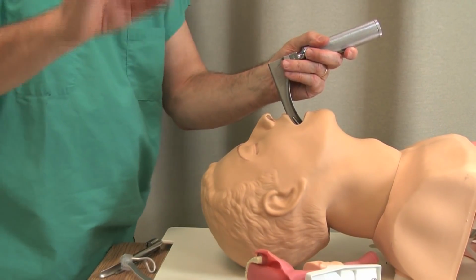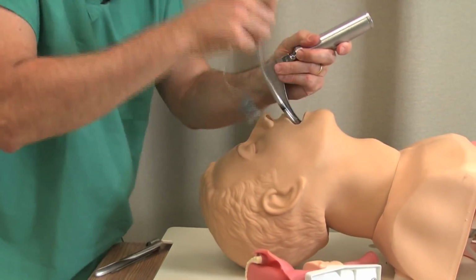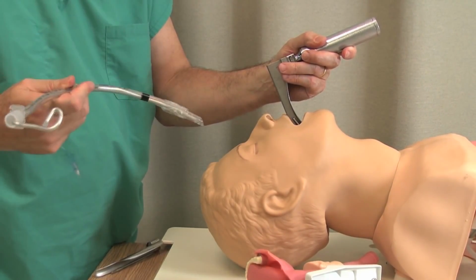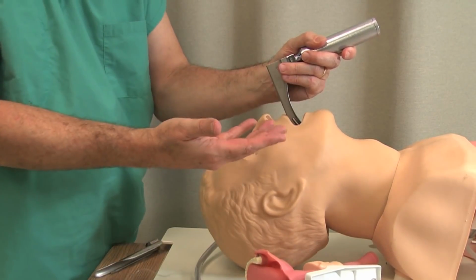Well, first I'm going to show you the wrong thing to do. The wrong thing to do is to keep trying to get that tube in. That's going to cause bleeding, edema, it's going to be a nightmare. Maybe you can't even get it. The next person that comes along is going to have to handle this nightmare.